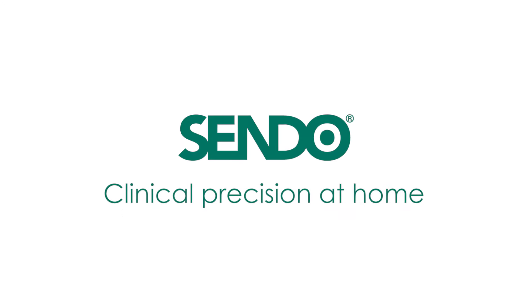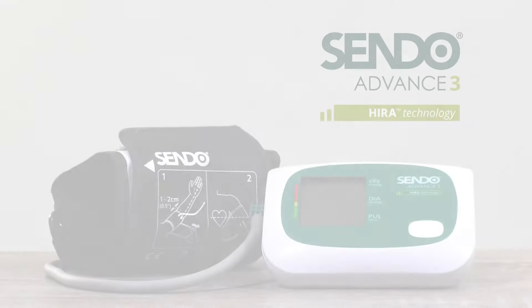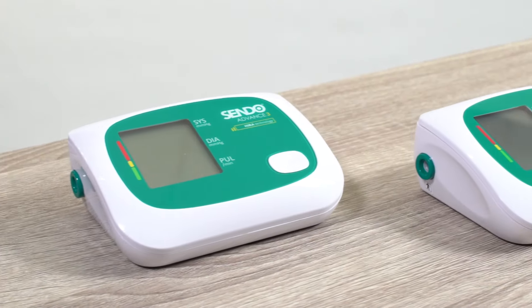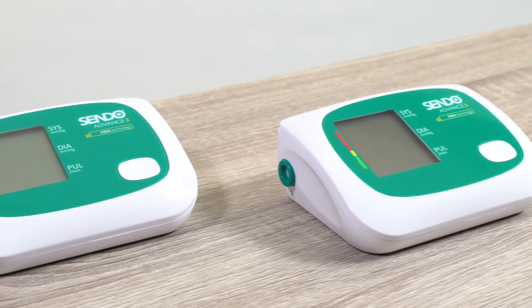Sendo — clinical precision at home. Sendo presents Sendo Advance 3, a fully automatic contemporary high-class blood pressure monitor.